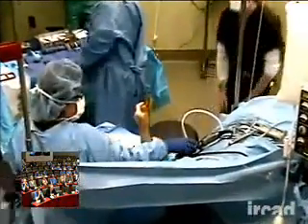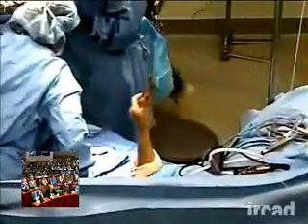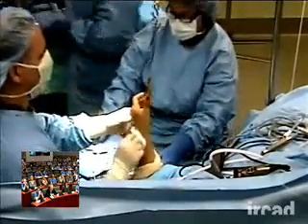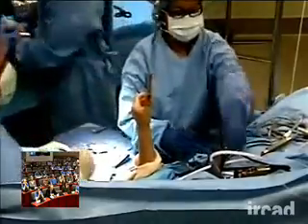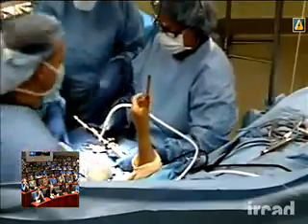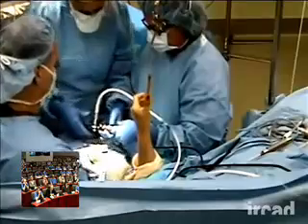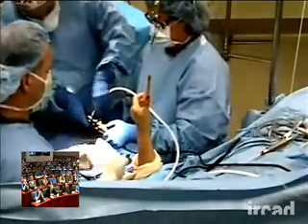You want to show them the x-ray? Where are you going now? Okay, now we'll show the x-ray of this patient. You changed the position. Good. This is a 65-year-old woman with 4 years of thumb pain. She's had 1 injection and splinting with persistent pain. We'll show you the x-ray now. She has an Eaton stage 3.